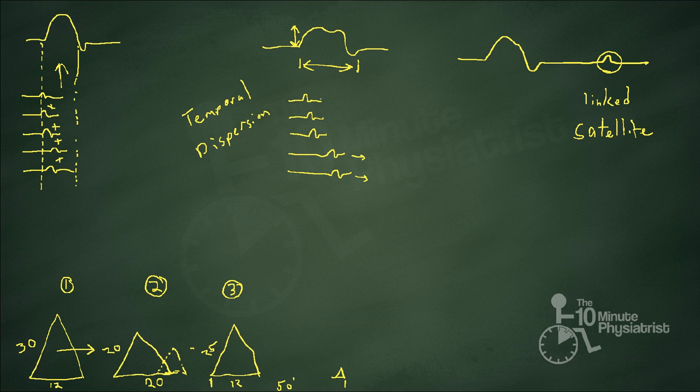A couple of real simple clinical examples. In the case of temporal dispersion, a disease state that might cause this differential slowing, where you've got more slowing in some fibers than others, and you get true temporal dispersion, you see that in disease states like Guillain-Barré, where you have focal demyelination, and the demyelination is patchy. You might see case 1, where we just see a movement of the potential over to the right, where everything slows equally, in disease states that cause more or less equal demyelination, like Charcot-Marie-Tooth.